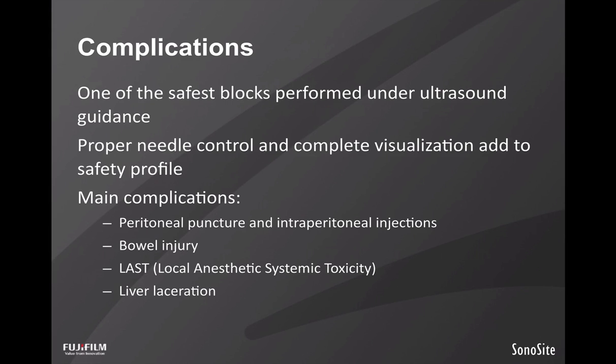Bowel injury, which goes hand in hand. Local anesthetic systemic toxicity, which goes hand in hand with the volume, which is why we described that at length, and liver laceration, which I have really not ever seen, but it is a described complication.